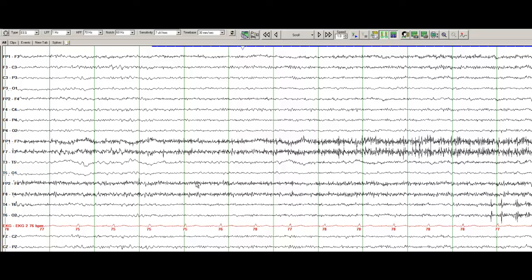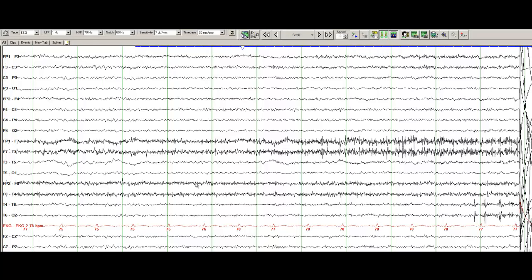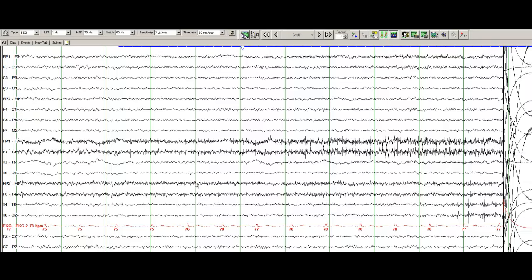The abnormality does not have to be in the left temporal head region — those electrodes are just recording it. Sometimes, depending on the electrical fields, the abnormality can be more anterior or posterior but recording from the temporal head region. The scalp EEG is more useful in lateralizing rather than precisely localizing. So you can be more comfortable that it is the left side of the brain which has some abnormality, but you cannot really point to the exact specific generator of that abnormality just from a scalp recording.